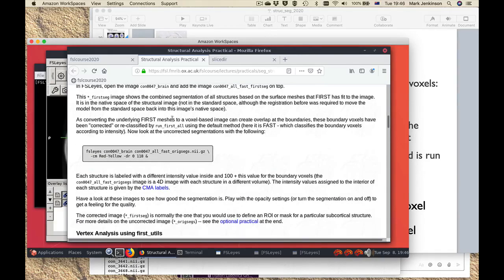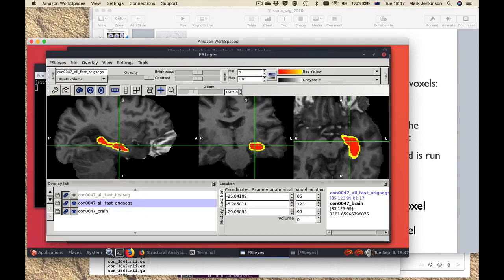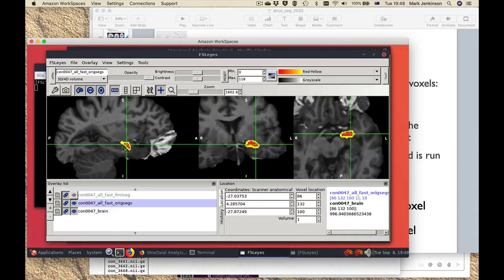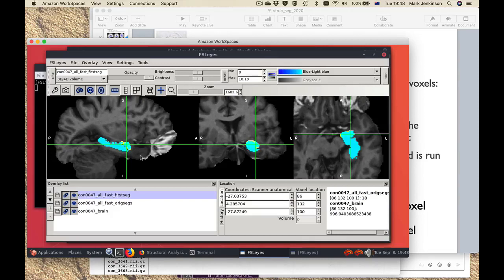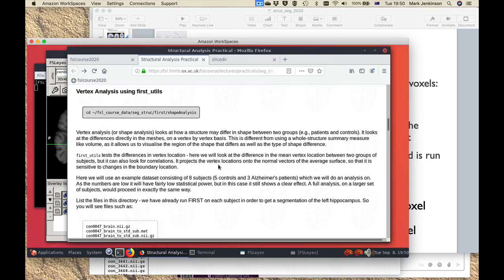The next part allows you to look at what's happened with the boundary correction, which was already run as part of that first command line — here we're simply viewing the results. The origsegs output contains information about what parts are considered interior and what parts are on the boundary, shown by different colors. It's also a 4D structure, so there are different volumes; I can click through the volumes and see different structures, because for each structure we have boundary voxels that can overlap — in this case with the hippocampus and the amygdala they do overlap. You can also look at the first-seg output, which is the corrected version after boundary correction has been applied. In some instances parts of the boundary shown in yellow have been removed as not part of that structure. That's the section on how to actually perform the segmentation — as you can see, it's quite simple.